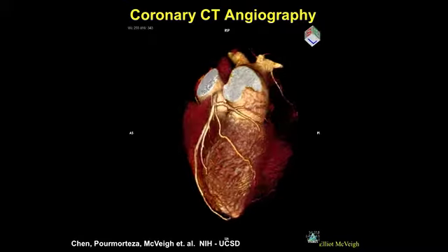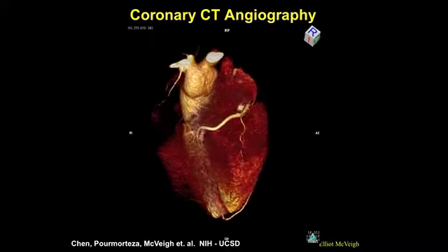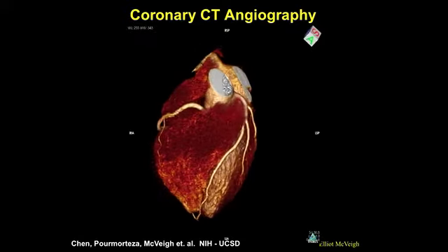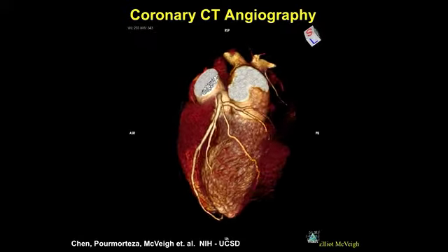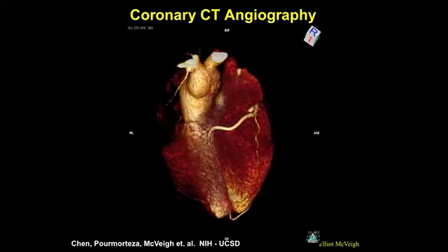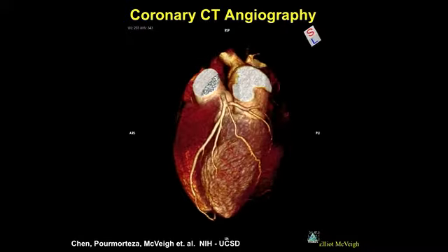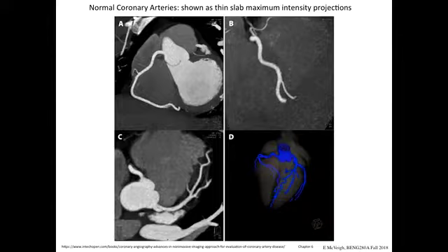And so that's why it's an extraordinary imaging technology, right? You can get that kind of data density at that speed, and pretty well nothing else matches it. If you have something, I'd like to know, right? So you can look at that image like that.